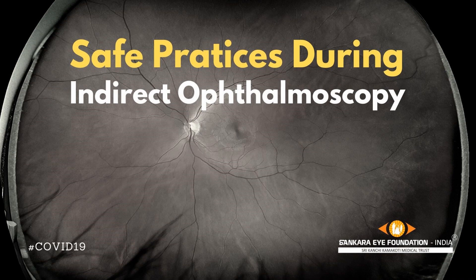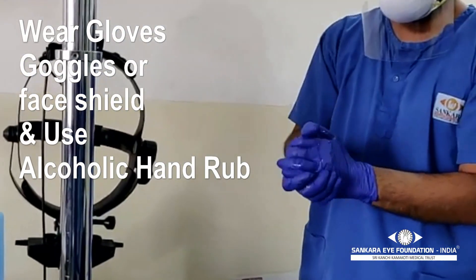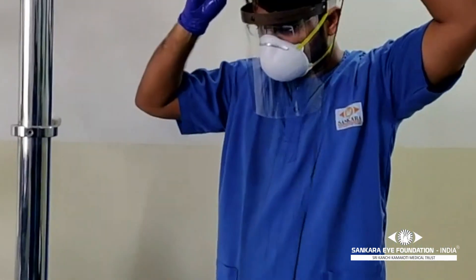This is a short video on the precautions to be taken during an indirect ophthalmoscope examination. Before beginning the examination, clean your hands with a hand sanitizer and then wear the indirect ophthalmoscope.